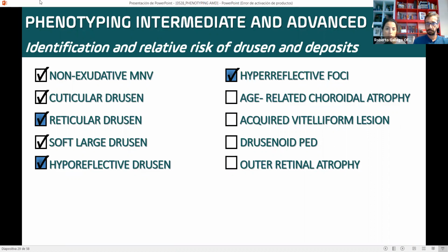In publications on clinical pathologic correlations with Dr. Curcio, we saw that some hyperreflective foci are related to pigment-derived cells, and in some other cases, they are cells filled with lipid or maybe activated microglia. So it's really difficult to say this is something.